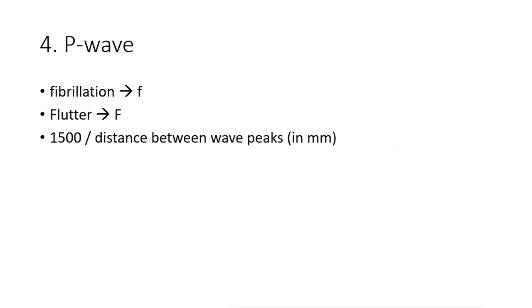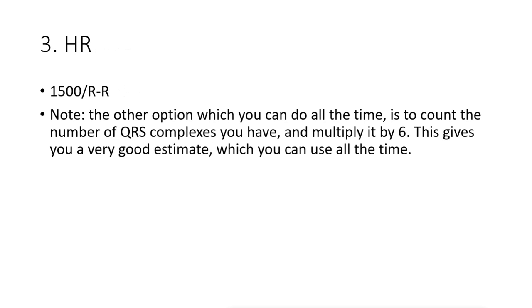Okay. So fourth thing is the P wave. We'll actually get into more details about this in a bit, so I think we'll leave this and push it later. So without further ado, I think we'll just start tackling some examples, and then we'll cover the rest of the points a bit later. All right?